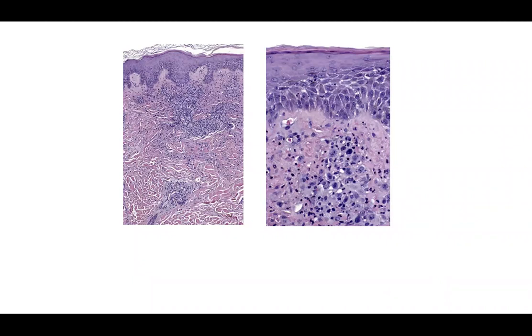We're going to continue with our unknowns. What's the inflammatory pattern here? It's mostly lymphocytic — in the dermis, at least the superficial dermis, maybe a little mid, perivascular or even periadnexal lymphocytic inflammation. Anytime you get lymphocytic inflammation in the dermis, you have to ask yourself: is it truly inflammation, is it neoplastic, or is it a mix of the two?